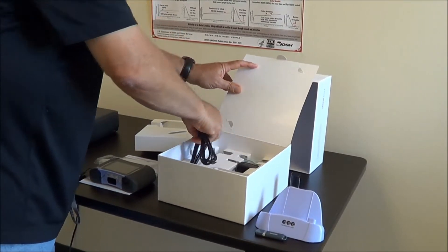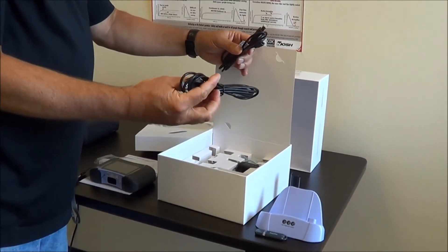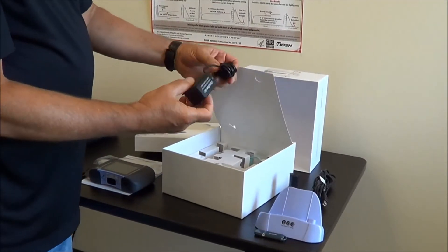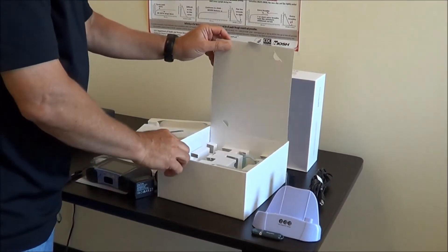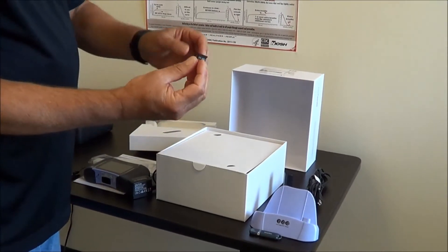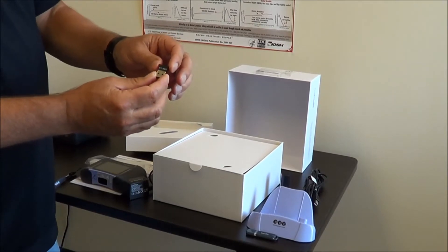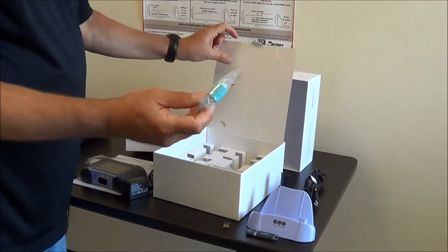We have a couple of cables here. One cable facilitates connecting the device to a printer or connecting the device to a PC. We have a power connector — an AC adapter that you would plug into the wall and into the rear of the device to keep the battery charged. We also have what's called a Bluetooth dongle. This device has Bluetooth capability, and if you have a laptop with Bluetooth you don't need this, but if your computer lacks Bluetooth this will give you that capability. And we also give you one nose clip as a sample.